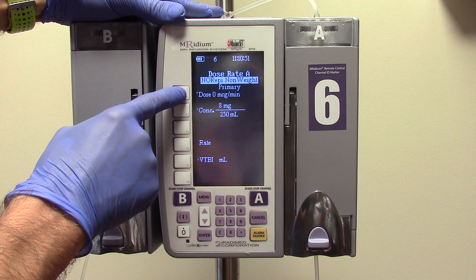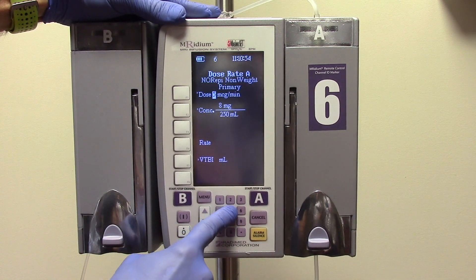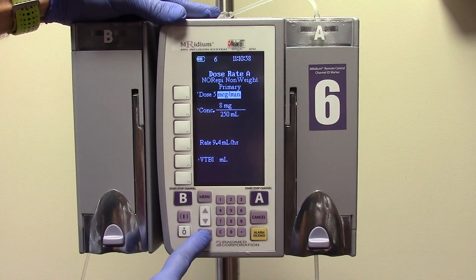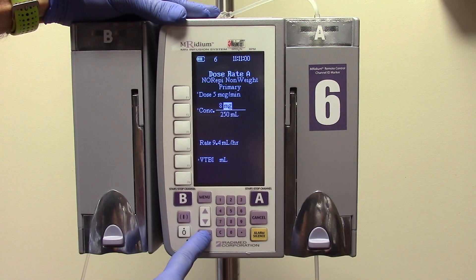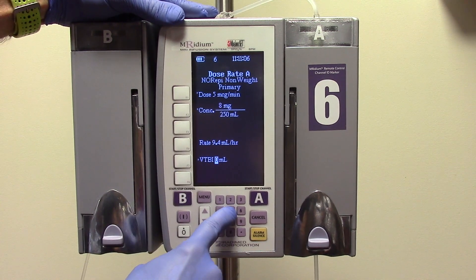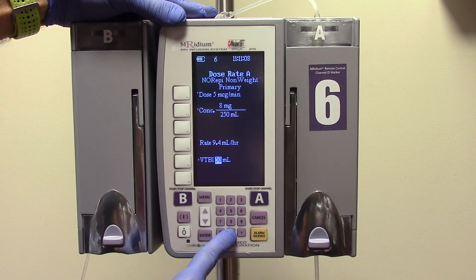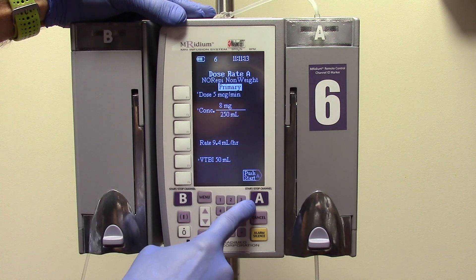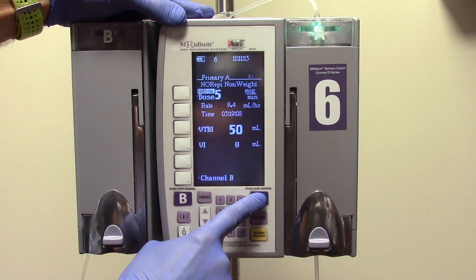Next, select the dose key and enter the ordered rate. Press enter to proceed. Verify the correct units, concentration, and rate, then enter the volume to be infused. Press enter. If the pump has been set up and programmed correctly, push start appears on the menu. Confirm that all clamps are open, then press the start button to begin infusing. The green flashing light indicates that the medication is infusing.